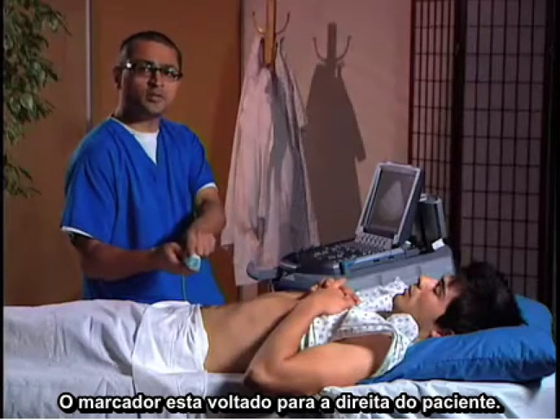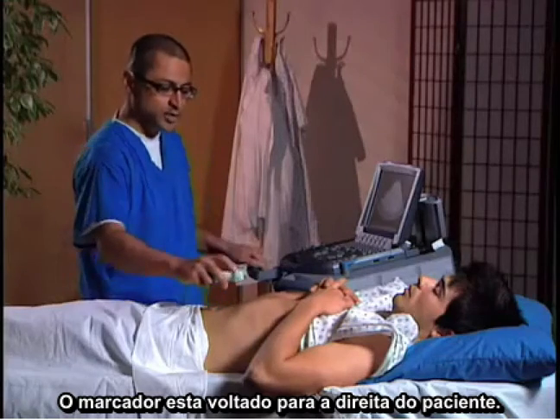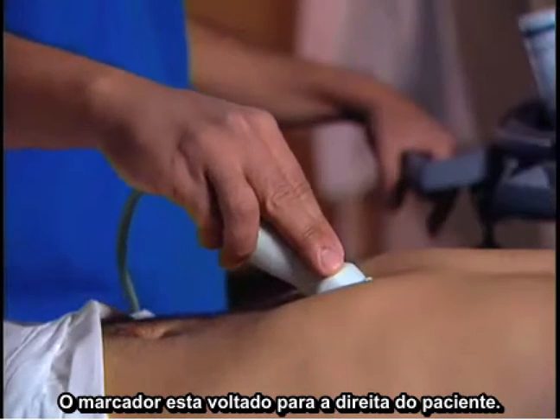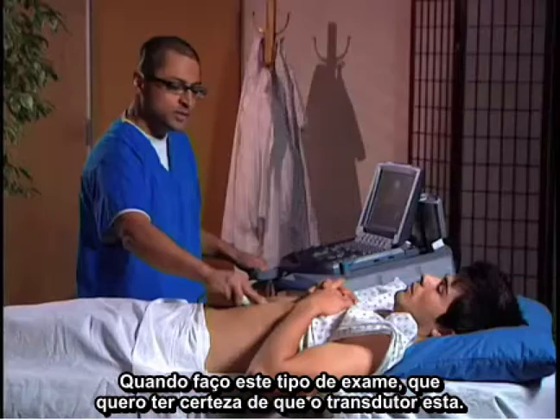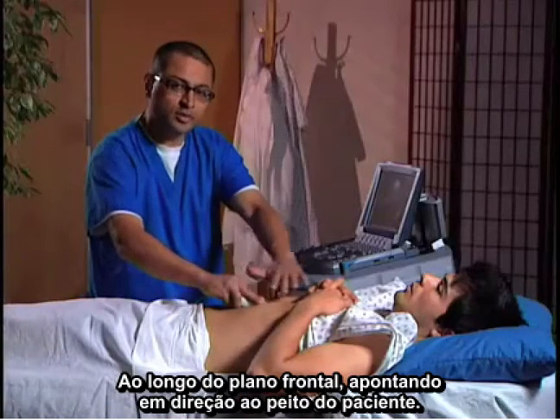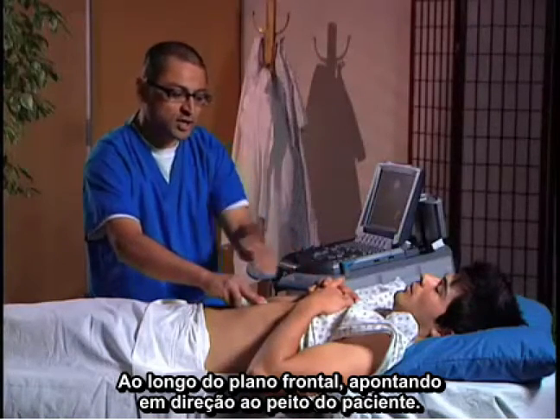Here is the probe marker, which I'm going to angle toward the patient's right. When I do this exam, I want to make sure this transducer is along the frontal plane and aiming toward the chest.